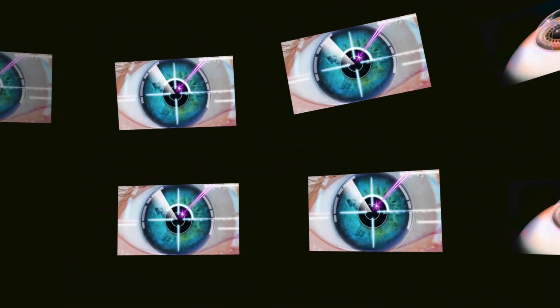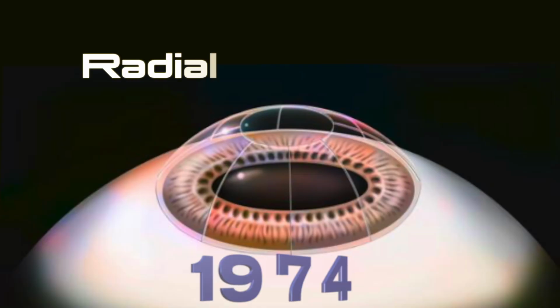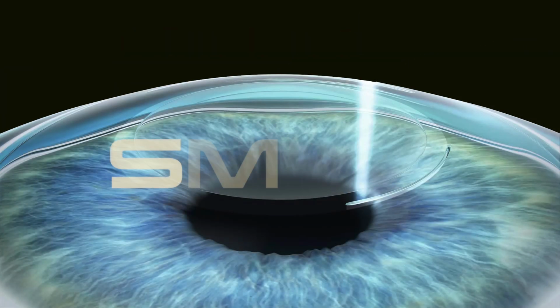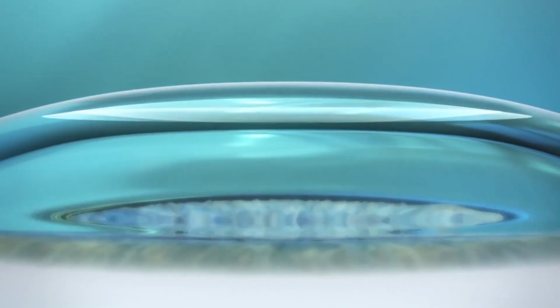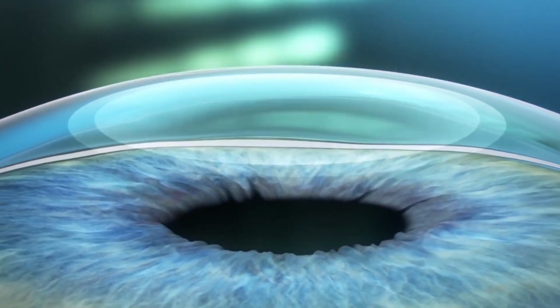Innovation connects the dots. Similar innovations have led the evolution of refractive surgery from radial keratotomy to PRK and microkeratome, to now the latest on the block, SMILE. In SMILE surgery, the lower interface of the intrastromal lenticule is created with the help of the laser, followed by the upper interface of the lenticule, known as the cap.